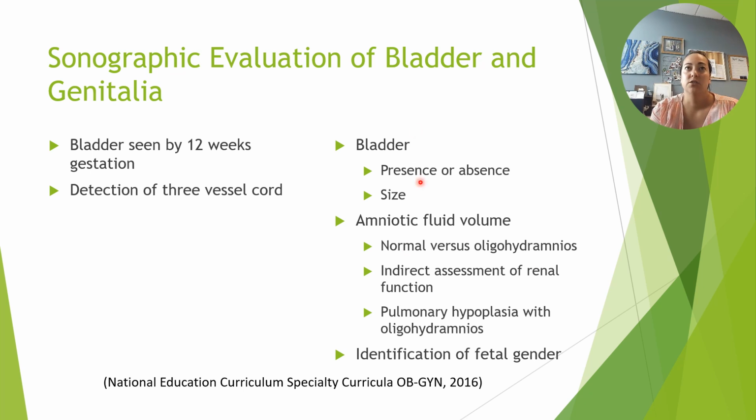So one thing to note about the bladder is it does empty about every 30 minutes to 45 minutes. So if you notice that there isn't a bladder, for example, initially, wait and reassess that later on in the exam. It may fill up over time, or if it's really dilated, again, wait and assess. Does it stay really enlarged or dilated, that bladder, during the exam, or does the fetus urinate and then it goes down to a more normal size? This is all going to help you communicate to the interpreting physician if that bladder is functioning normally.